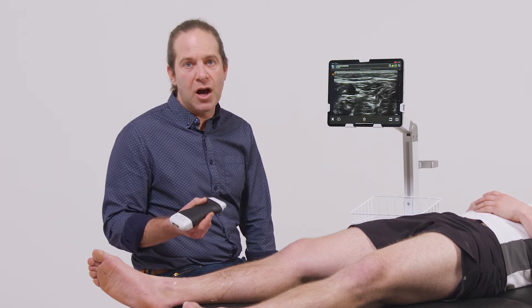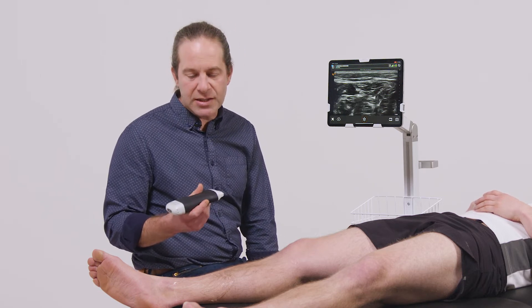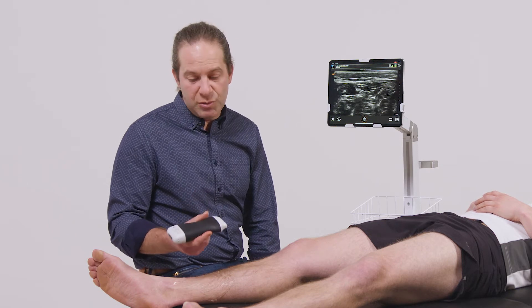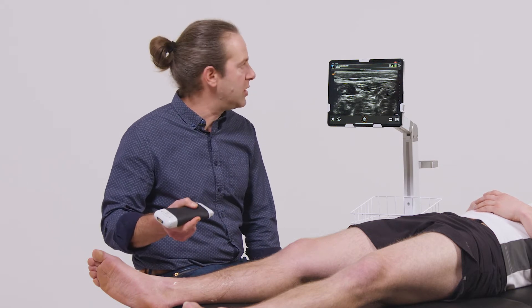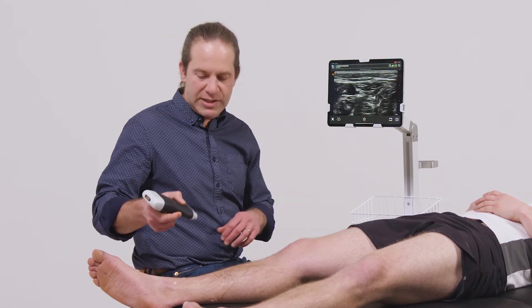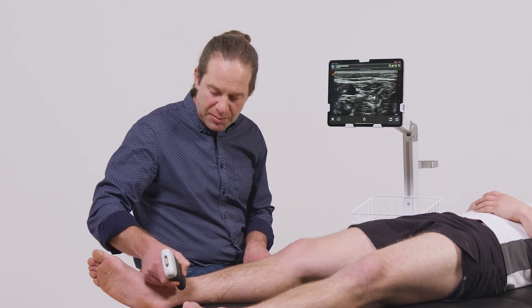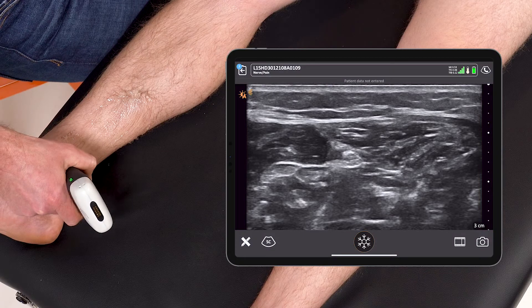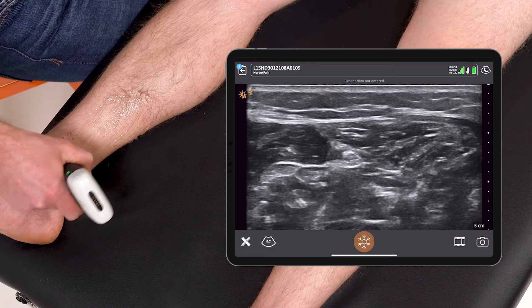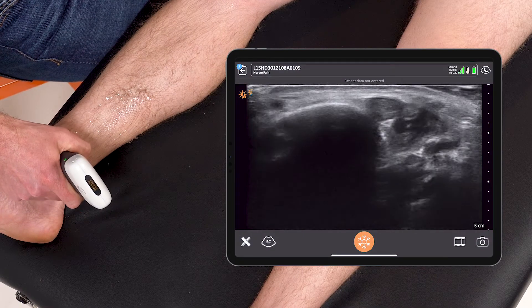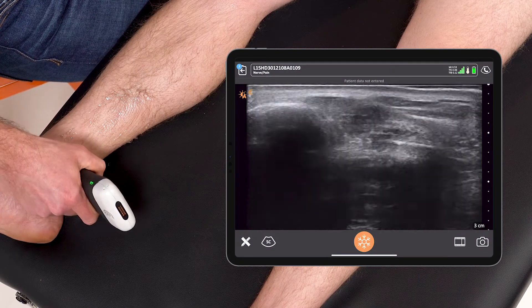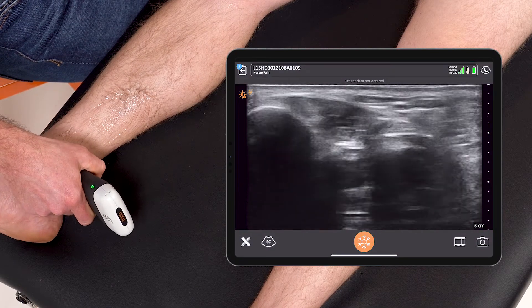In this example, I'll show how to identify the posterior tibial nerve under ultrasound guidance in preparation for a nerve block. I'm using a linear scanner here on the nerve preset, and I'm going to start on the medial aspect of the leg, just proximal to the medial malleolus.